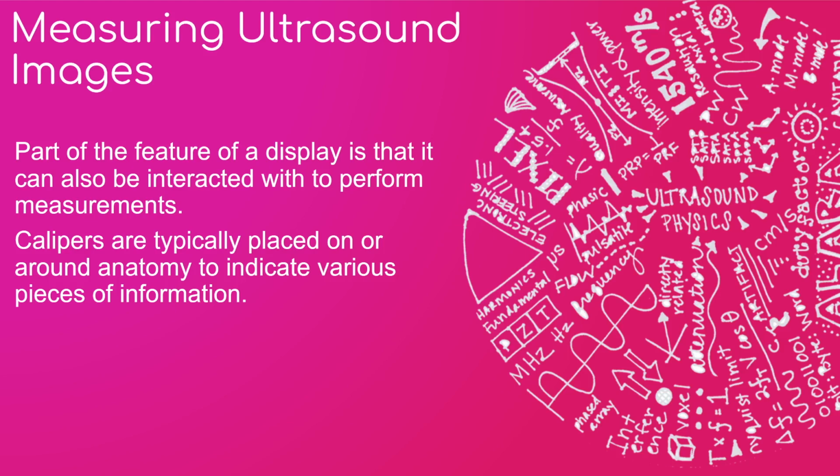And then on top of that, we have computer components that now can recognize how deep we are, where we are at, so we can measure the echoes that we're getting back. So with that, we place calipers around on the B mode image. We might place them in the M mode image, or we'll place them on our spectral tracing. And when we measure, those calipers come up and they tell us different information.